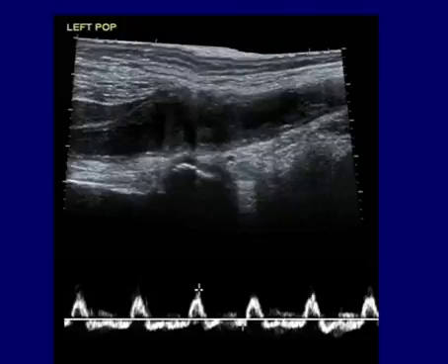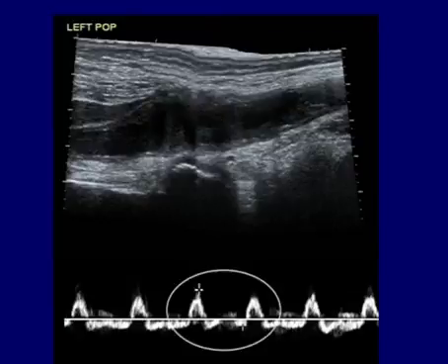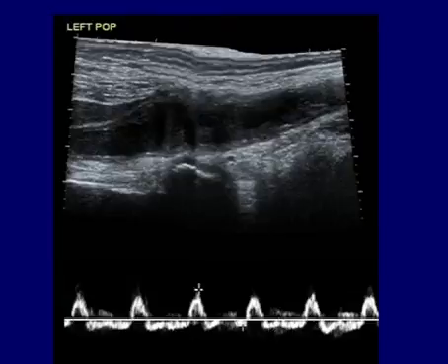In this image, we have an extended field of view of the popliteal artery where we see, again, normal diameter here, the aneurysm, and then tapering back down to a more normal diameter. And I put this in here to show you that if we Doppler through the vessel, say at this point here where it's dilated, we're going to see some pretty unusual waveforms. We'll see a fair amount of turbulence, some retrograde pattern, because as the flow comes down, it's nice and laminar, and then it enters this dilation, and then we see a lot of reverse flow components and eddy flow and things like that that will disturb what we normally expect to see in a peripheral artery.